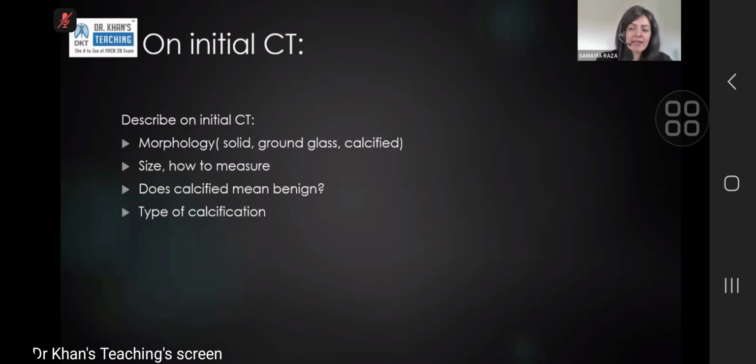When it has no fat, only has calcification, it is significant size, it's slightly irregular. Do you want to bank on the fact that this is a hamartoma, or would you rather biopsy it? Bigger centers, complex centers would biopsy it.